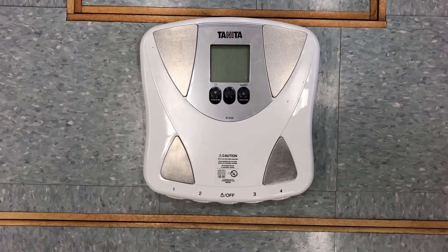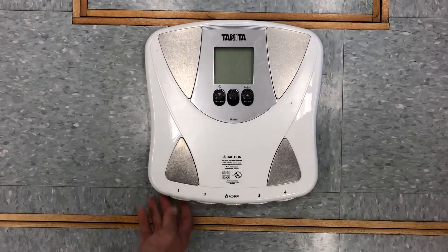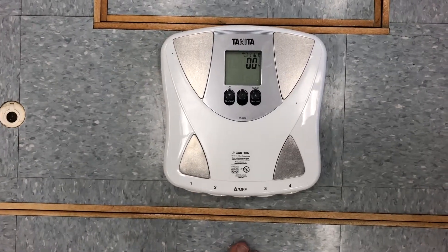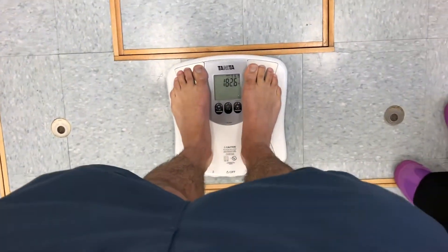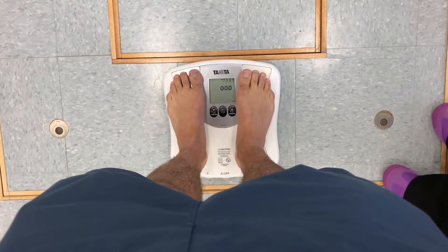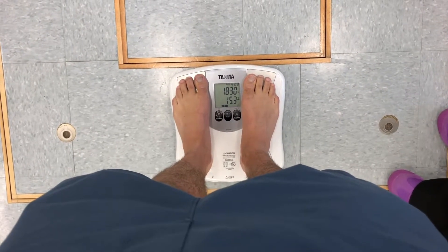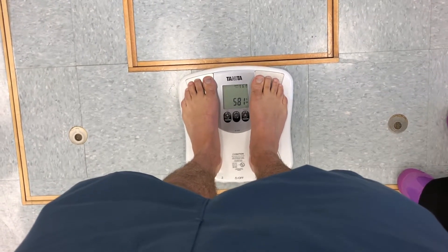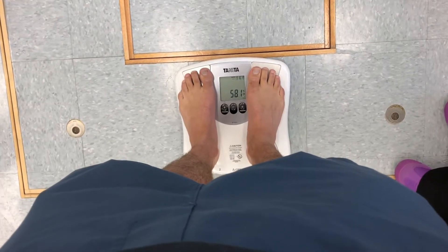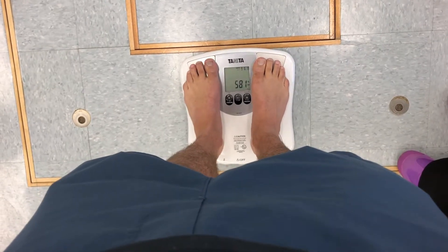Once you've programmed the date and the user data, you're just going to click on the number that you programmed — here we have number one — and you're going to step onto the scale. Make sure that your heels are in contact with the electrode surface, and all you have to do is stand quietly and still while it takes your recording. From this, you're going to get your weight, listed here as 183 pounds, your percentage body fat, here 15.3, and total body water. Record those values into your lab manual and then move on to the next BIA scale.